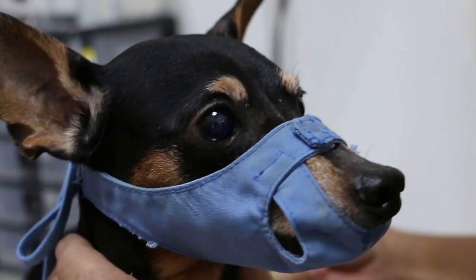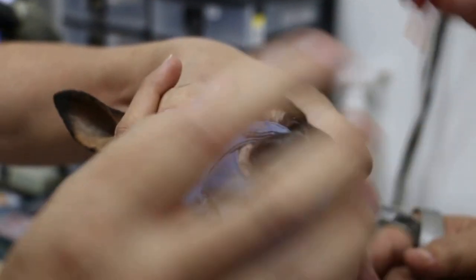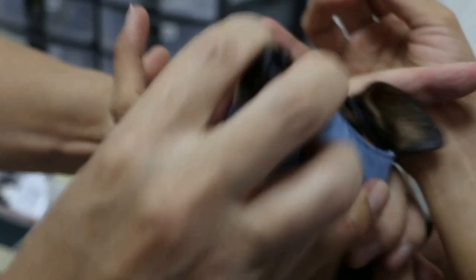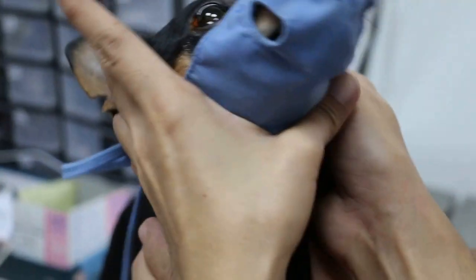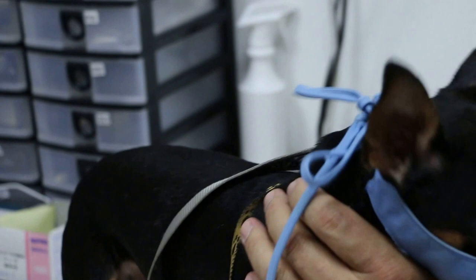Please hold the head first. So I will use this — do the check for ulcer. Hold the dog and put the dog in. Normally I do both eyes in case the other eye is also affected, so do this eye also. Now when there is an ulcer it will be green in colour — it will take about one minute. Green in colour shows that the cornea is ulcerated due to injury or scratching.